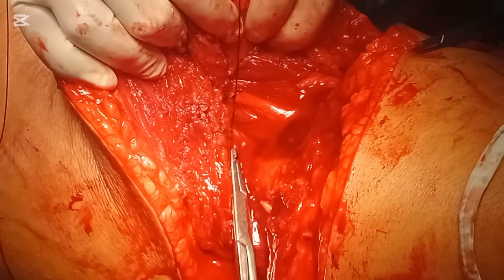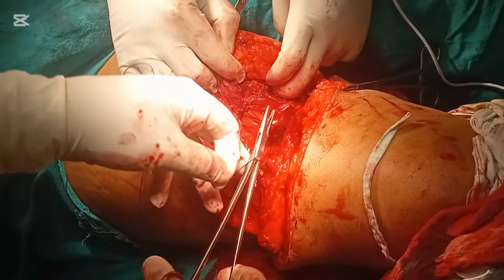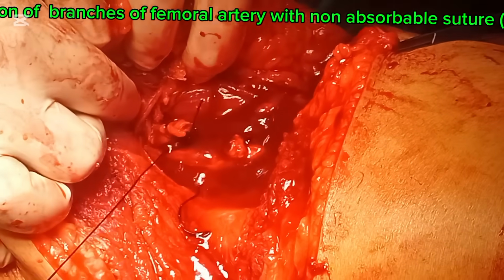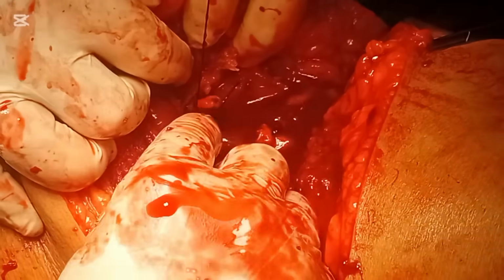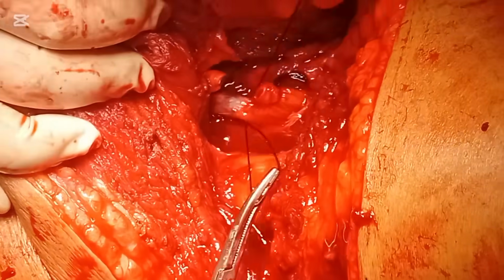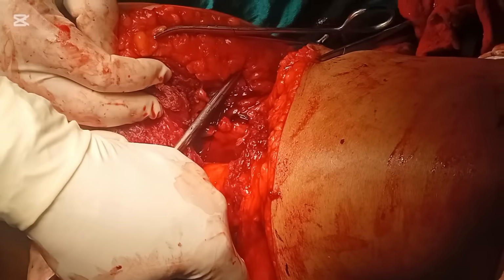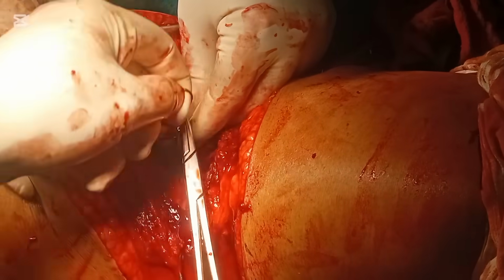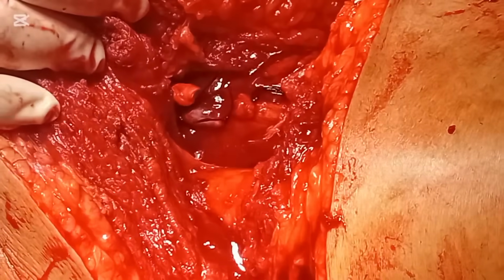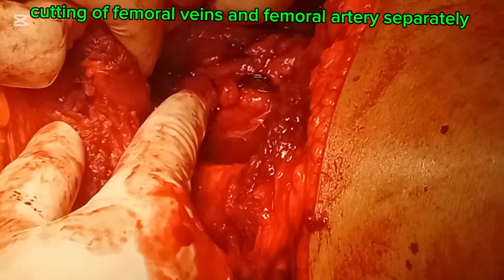We will assure the hemostasis by securing the knots tightly so that blood flow is completely obstructed in the femoral artery. Now a branch of the femoral artery is being ligated. It is very necessary to ligate all branches of the femoral artery. Assure complete ligation of all branches of the femoral artery, otherwise it will dribble down the blood and make your field wet, so it may hinder your procedure.